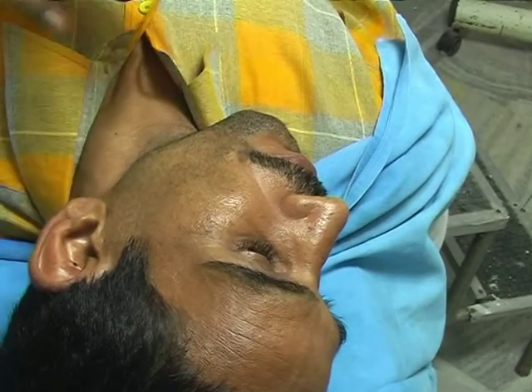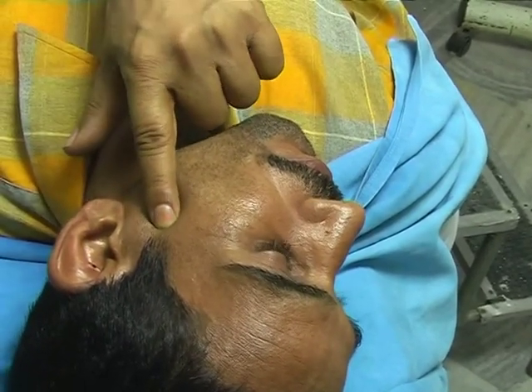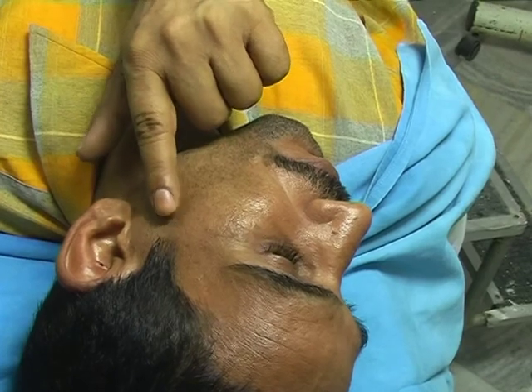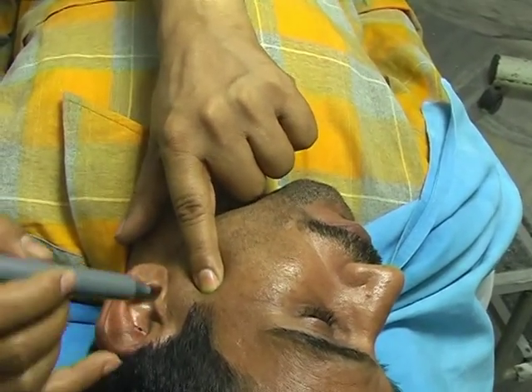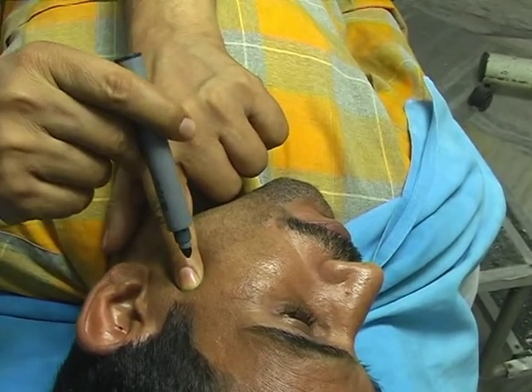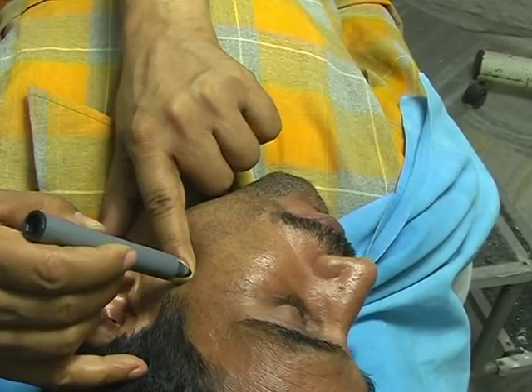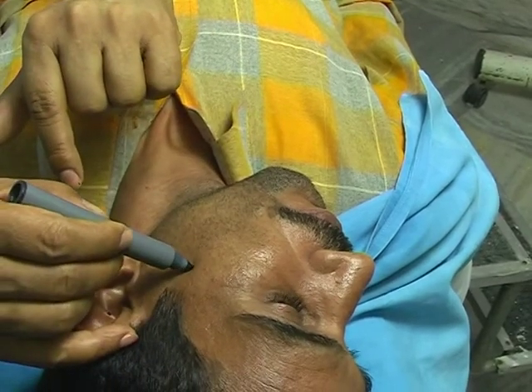So I am marking the anatomical landmarks. Just put your index finger in the mandibular notch here. This is the zygomatic arch here. So I am putting my index finger in this mandibular notch and mark a point at the ulnar corner of the nail — this is the radial, this is the ulnar side of the nail — and put a dot there. This will be the entry point of the needle.